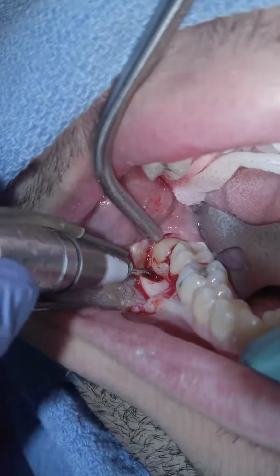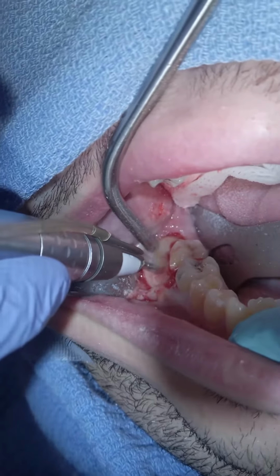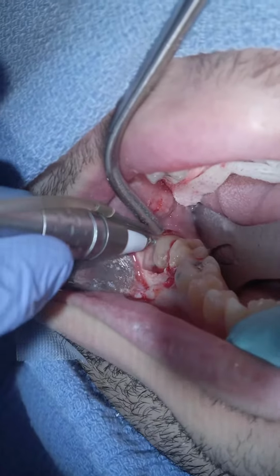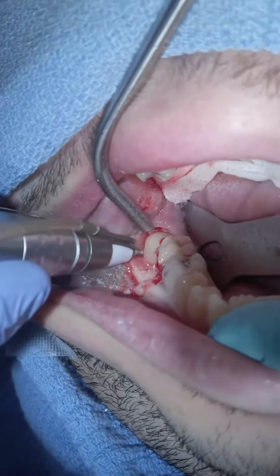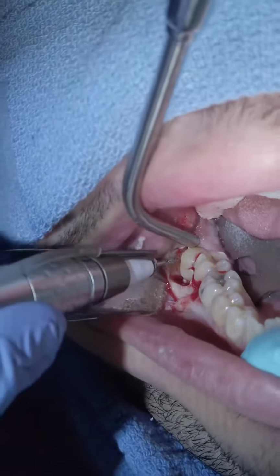Okay. So what we're going to do, just like we discussed on the x-rays, is do a little section right here and go all the way across. Boom. All right, so that's what we want. See that? Okay, yeah. Beautiful.